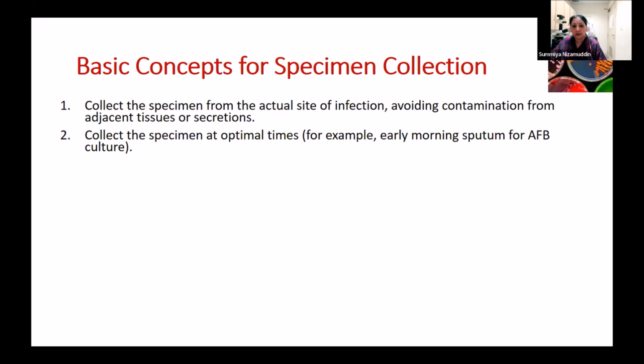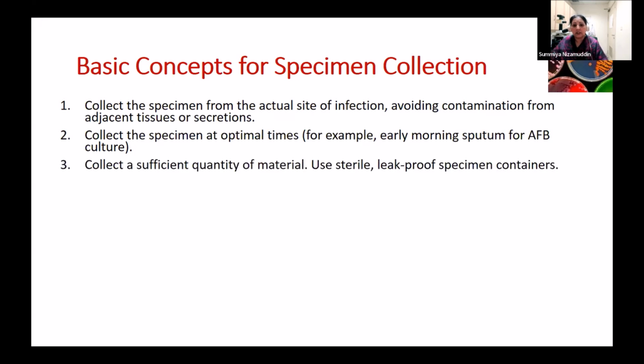So for certain specimens, there are certain optimal timings that are advised by the lab. And it's always helpful if you could communicate this information to your patient if you need credible results from those samples.